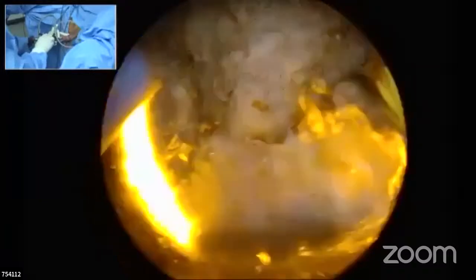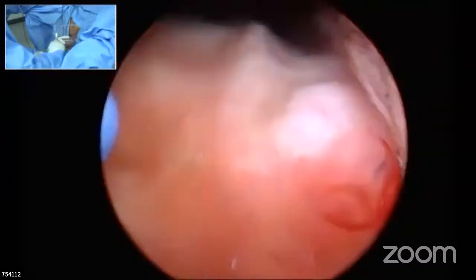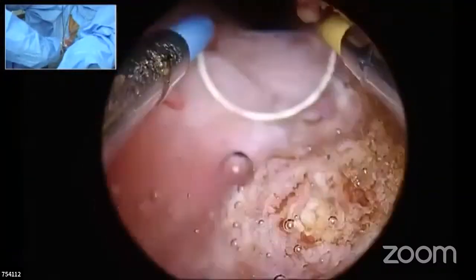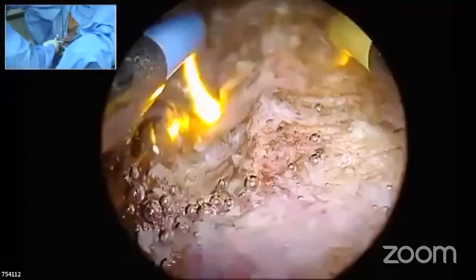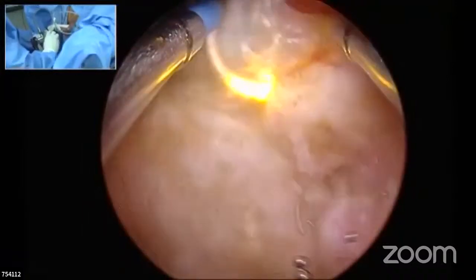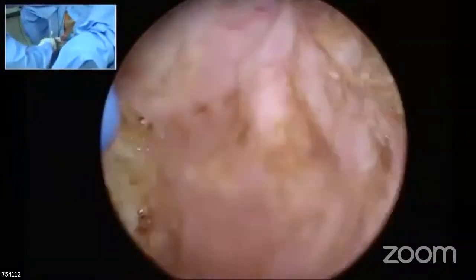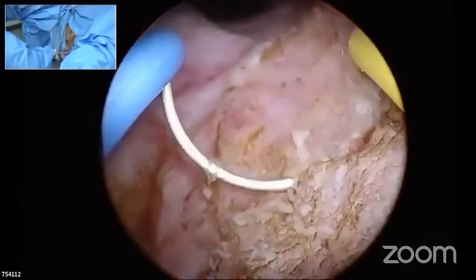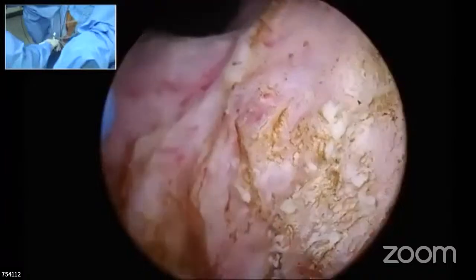The second thing is the movement, as we have already discussed. If you are having a slow movement, your cutting has to be smooth, there is no doubt. But with a slow movement, your simultaneous coagulation goes on and your bleeding will be much, much less. Point coagulation, I 100% agree. When you are doing it with bipolar, the duration of the coagulation at that point has to be slightly more than with monopolar. Otherwise, as you know, the heat generated is less in bipolar, so the bleeder may open up later on. Initially, when bipolar was started in 2002 or 3, it was also discontinued because of the fear of a lot of bleeding. They were very fast in cutting. That's why there was more bleeding.